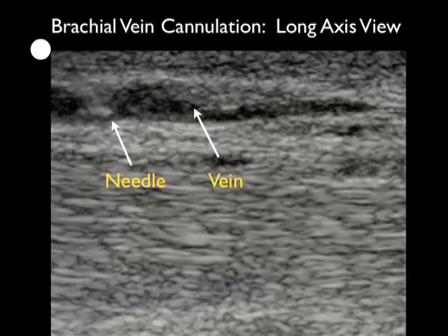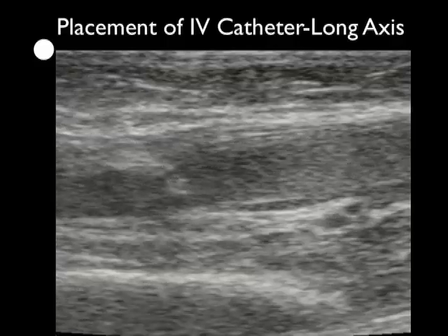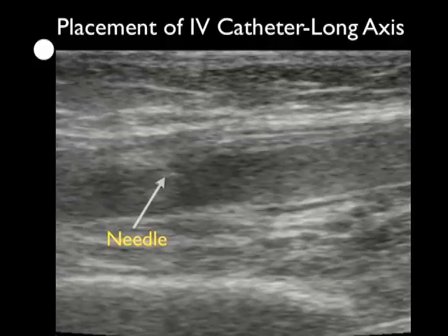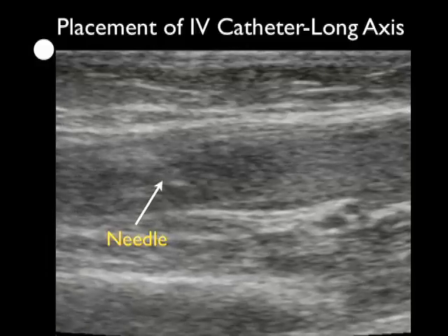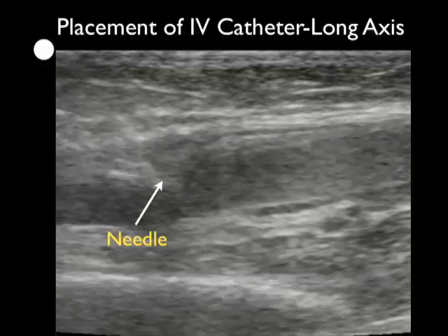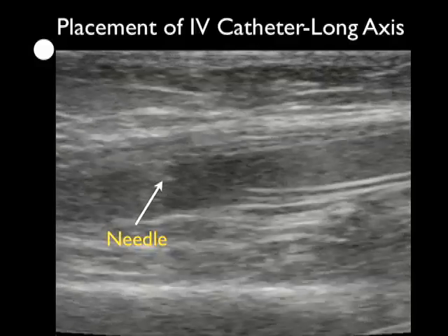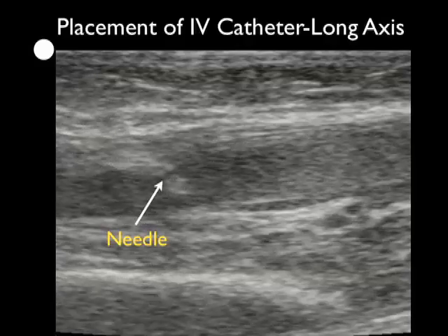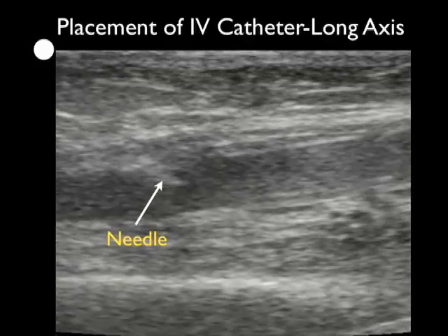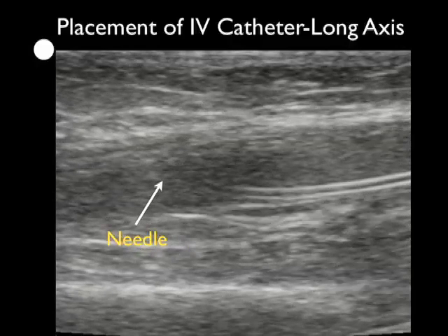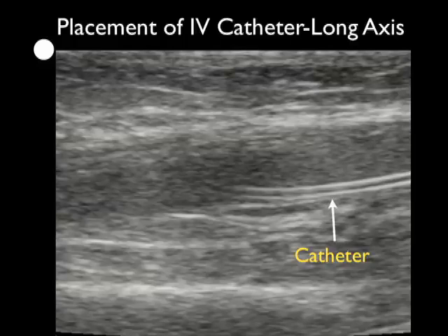At this point we're ready to thread the catheter. This video clip captures a long axis cannulation of a deep arm vein — we can see the needle coming in from left to right and the needle tip permeating through the vessel lumen. Now we can see the actual threading of the plastic catheter. We'll freeze it so we can see the plastic catheter securely within the lumen of the vessel. It's nice to visualize the catheter within the vessel lumen to ensure there's enough catheter there to deliver medications and fluids without extravasation into the patient's arm.